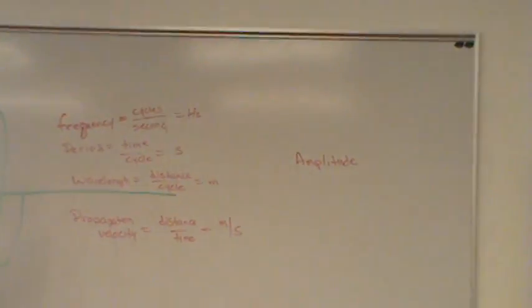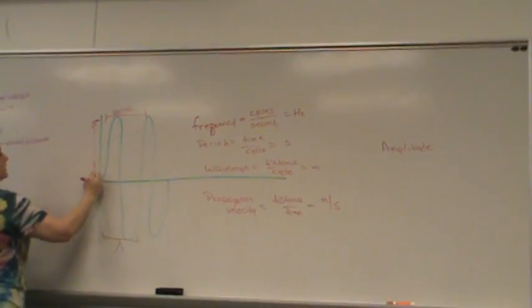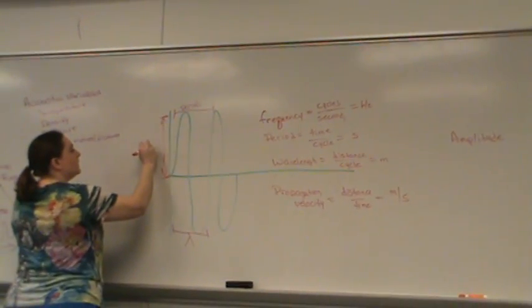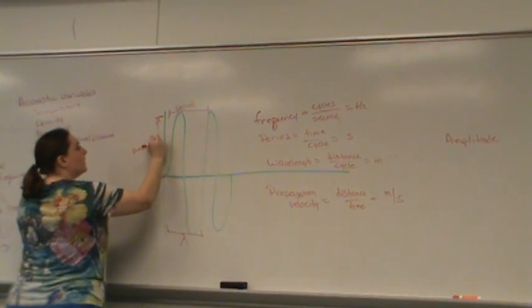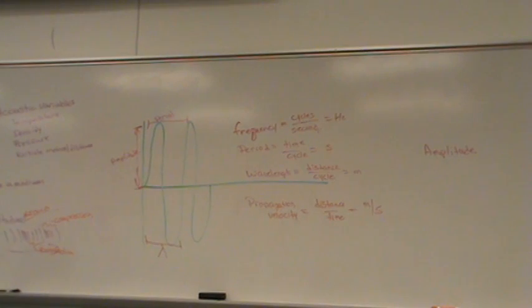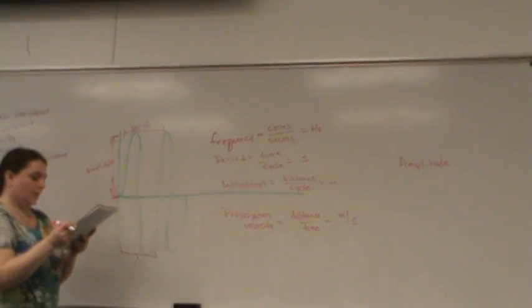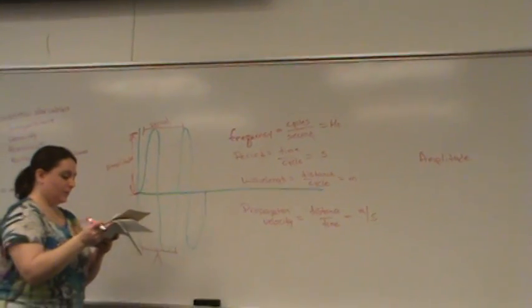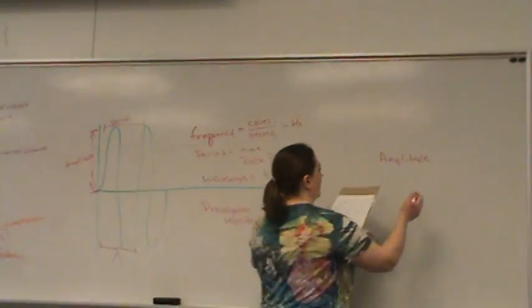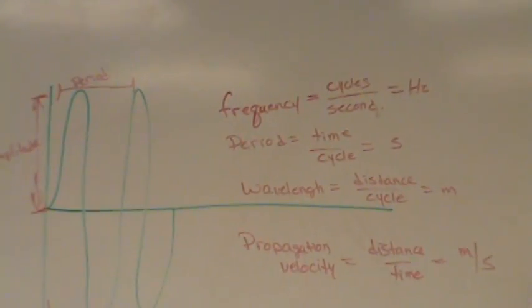So that's, you know, this here, this dimension of the beam here is amplitude. Let me see what I wrote down. Catch up with my notes. There were several different ways that we looked at amplitude.